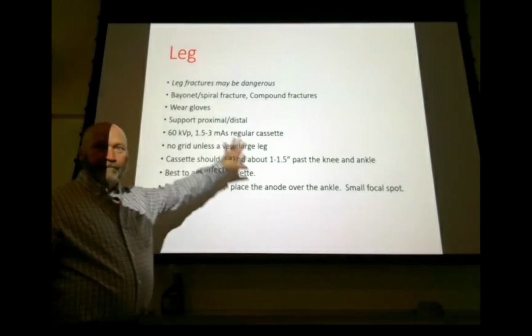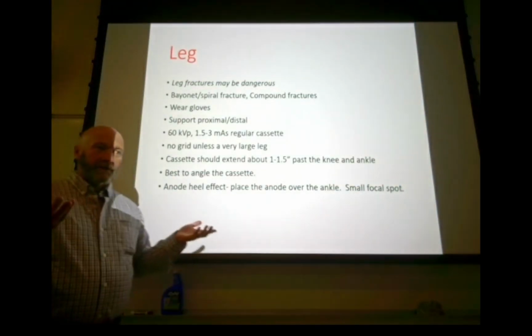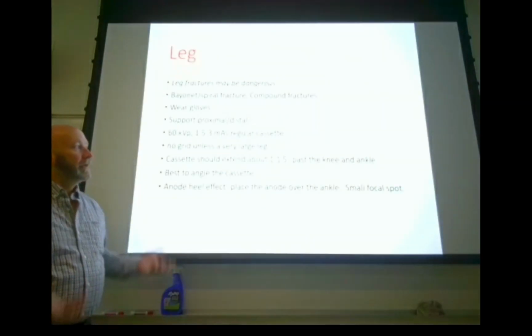That's a minor diversion from this, but what I've found sometimes with the long bones, especially in the tib-fib, is if the patient potentially has a compound fracture or some sort of laceration, the ER staff, nurses aides, whatever, have a tendency to clean up the patient before we get to them sometimes, right? And then you go to pick up this patient's leg, and what you find out is that they didn't move the leg to clean them up, and now your hand's full of blood, right? So wear your gloves, because you just don't know where there's a laceration or potential compound fracture.